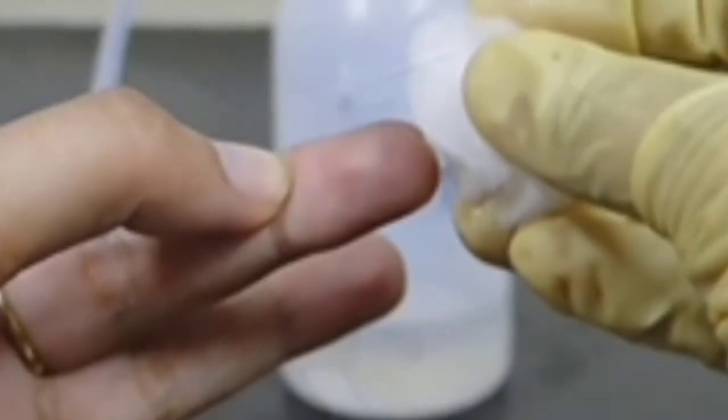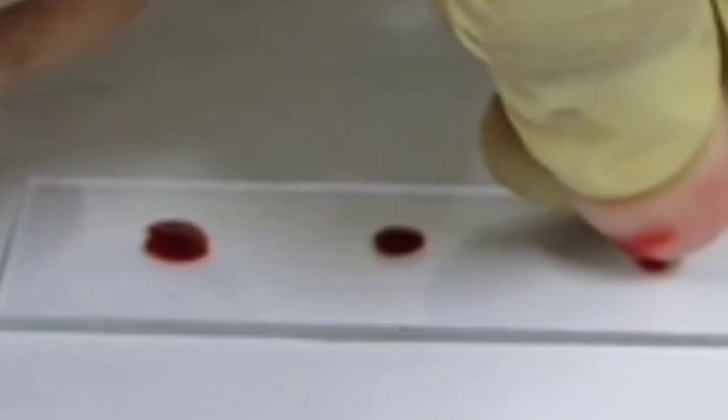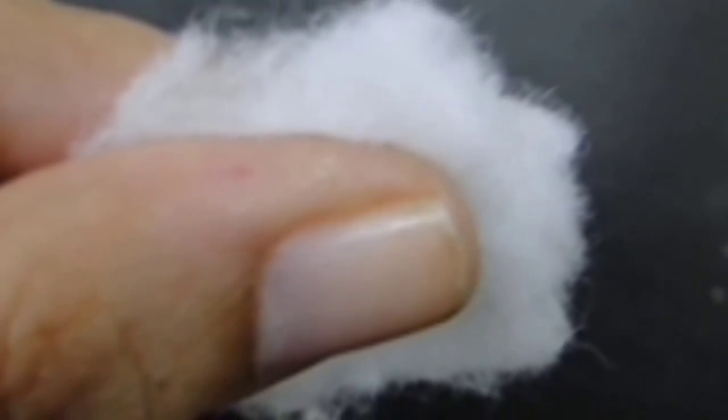Procedure: swab the finger with cotton balls dipped in spirit and take a blood sample using a lancet as shown. Take 3 separate drops of blood on a glass slide. Place a cotton ball on the finger to stop the blood flow.